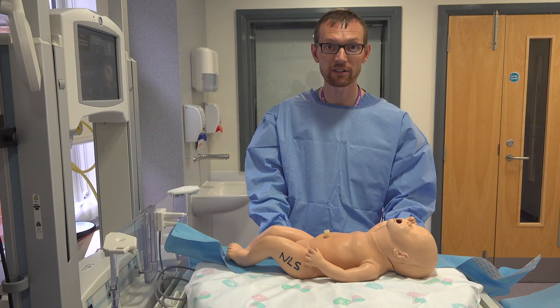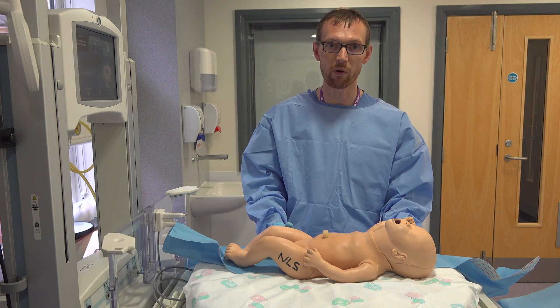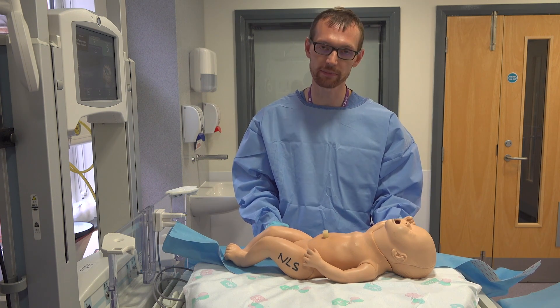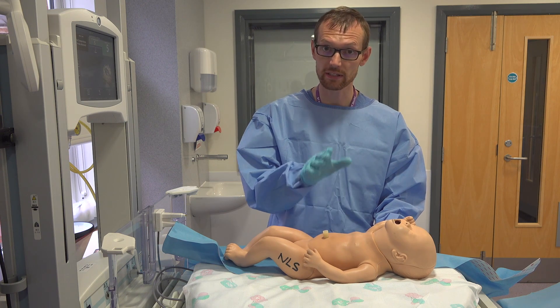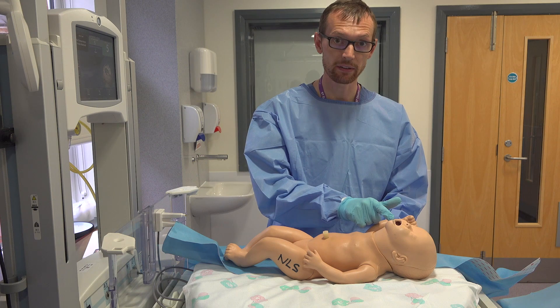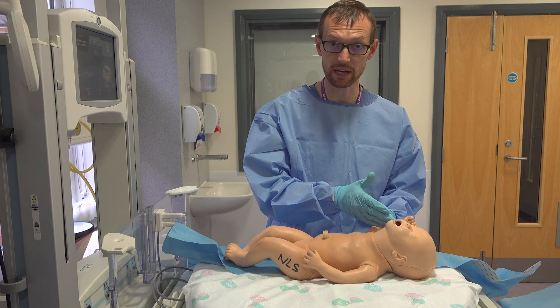So now we're ready to insert a chest drain, which is a more definitive way to drain your pneumothorax. We've done our needle decompression which has stabilised the baby. We've stabilised our airway, whether that's continuing CPAP or intubation.